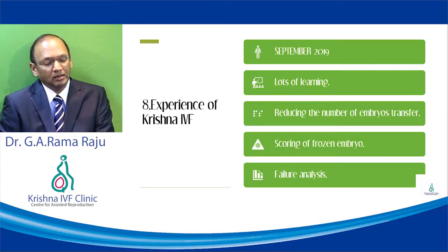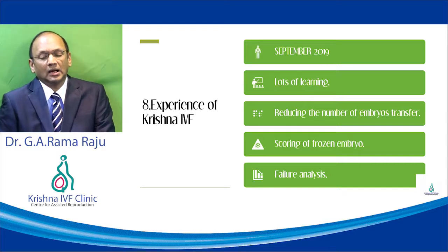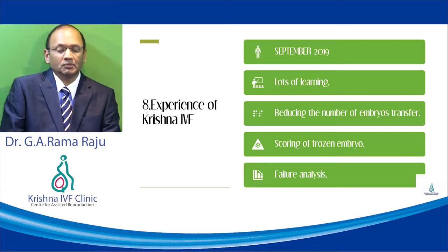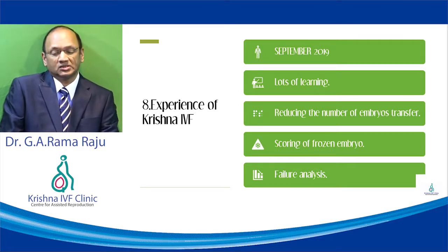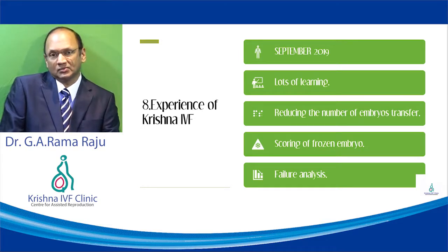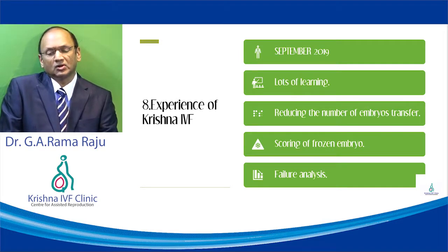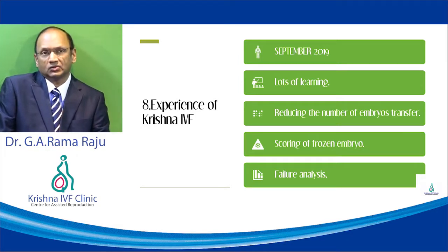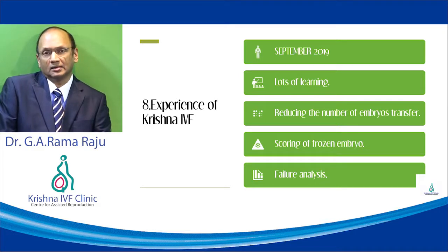And when we look at our experience, we started using time lapse from September 2019. Our whole understanding of embryology has changed. We are able to reduce the number of embryos that are transferred, and we are also scoring the embryos which we are freezing, so that we are able to transfer embryos which have better morphokinetic parameters, so that embryo implantation is better.